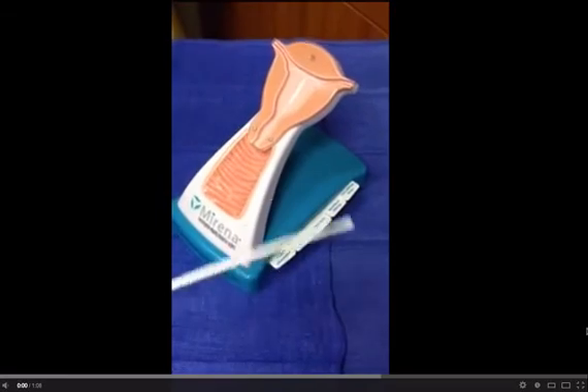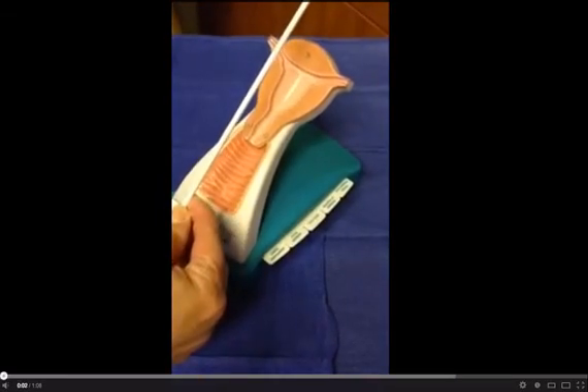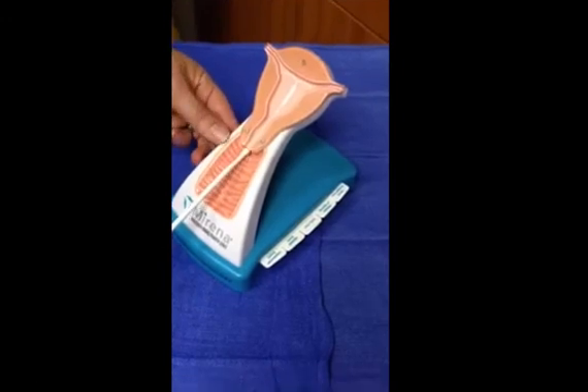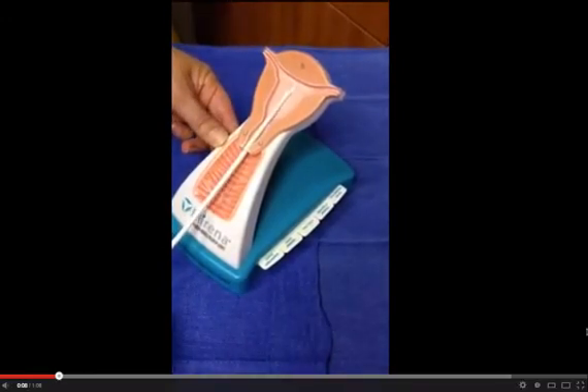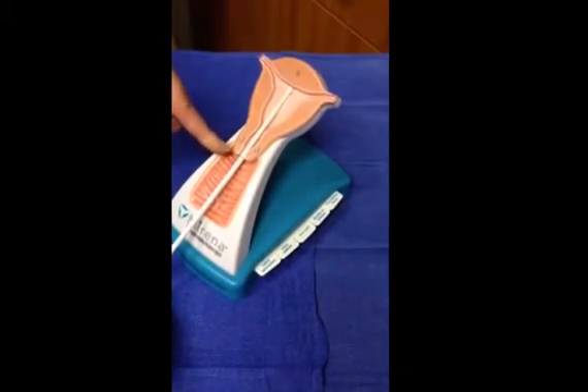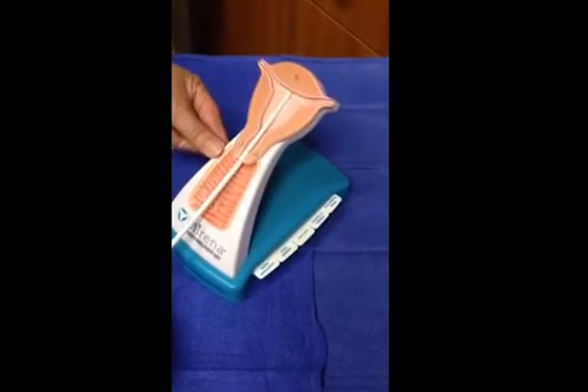IUD insertion: here is a video showing how to perform an IUD insertion. First, perform a pelvic exam. Then cleanse the cervix with betadine, as long as the patient has no allergy. Place a tenaculum on the cervix.